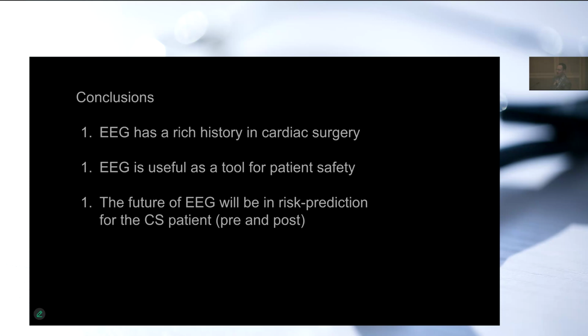If you want to do that manually, where you feed in an artifact-free segment that you have scrutinized yourself, then it's quite easy. But if you want a machine to actually decide this is an artifact-free segment, it's actually a difficult problem. And it turns out that that seems to be the most difficult element of the question you're asking. It's just, can a machine determine what is an artifact-free period of EEG that makes sense to use as its interpreting database? To provide it a database of already filtered data is quite easy, and that's the training data set for that machine learning algorithm. But to then say, okay, find me a piece of data that resembles that data set is actually a really difficult challenge.